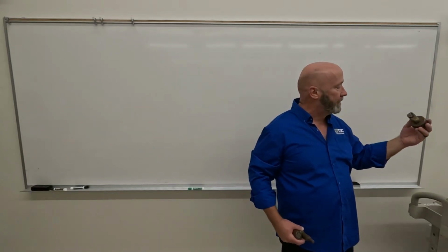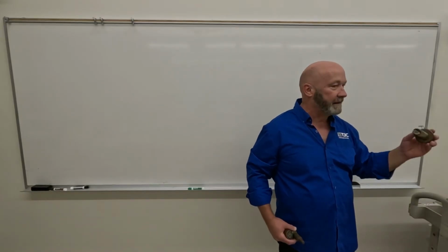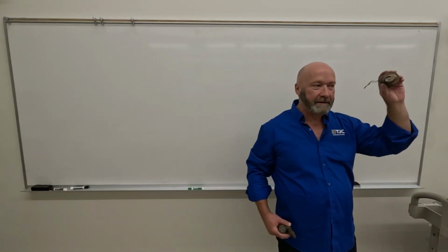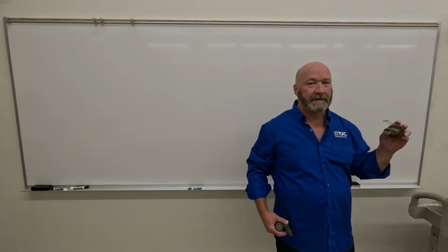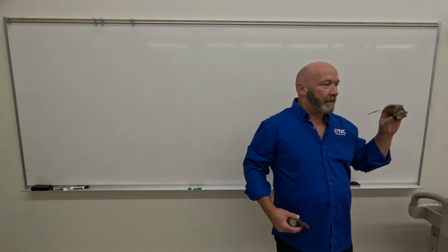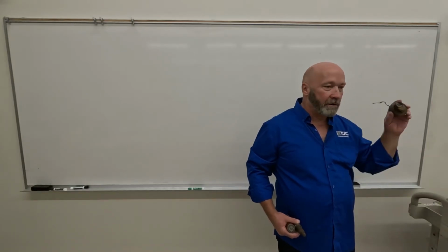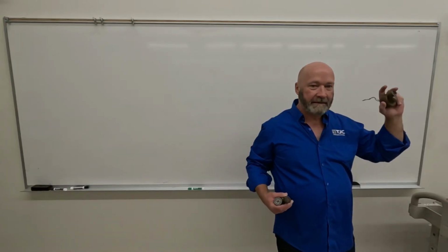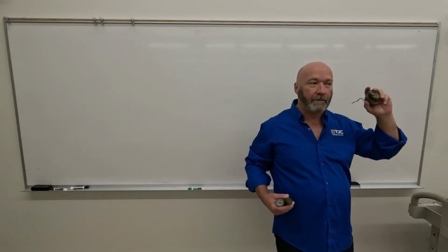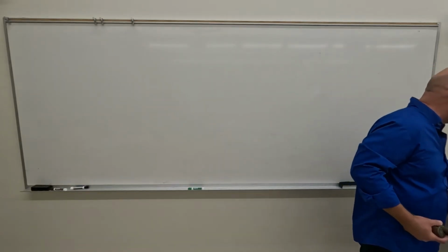And what you'll notice on this, if your eyes are better than mine most likely, is there are 2 filaments, and the only difference between the 2 filaments is that one's longer than the other, and we'll talk about the significance of that here in a bit. But also what you'll notice is that they are countersunk inside of this thing, and this thing is what we'll refer to as a focusing cup. I'll again talk about the significance of that.